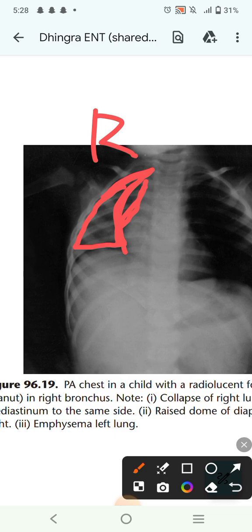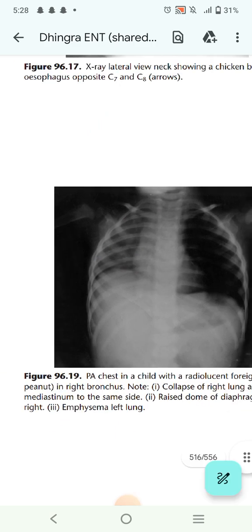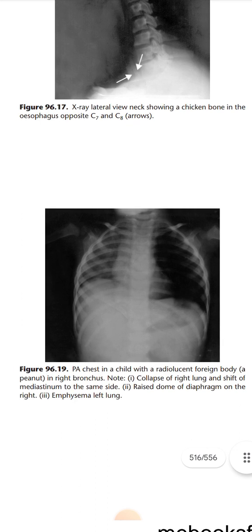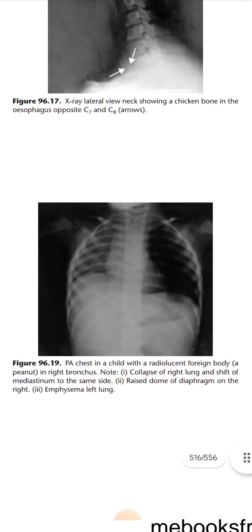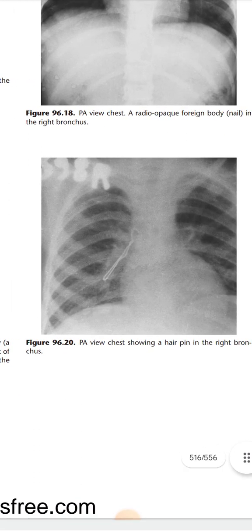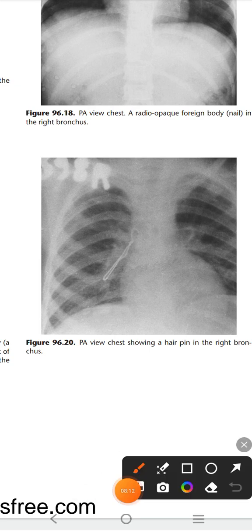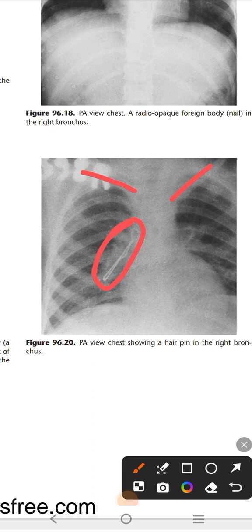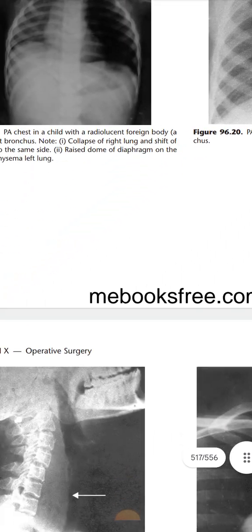This is a PA chest x-ray in a child with a radiolucent foreign body — a peanut — in the right bronchus. Because it is radiolucent, it cannot be directly visualized, but you can write: collapse of right lung, shift of mediastinum to the right side, raised dome of diaphragm on the right side, and emphysema on the left side. The next PA view shows a hairpin in the right bronchus.